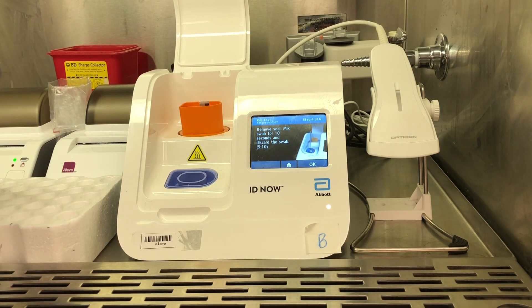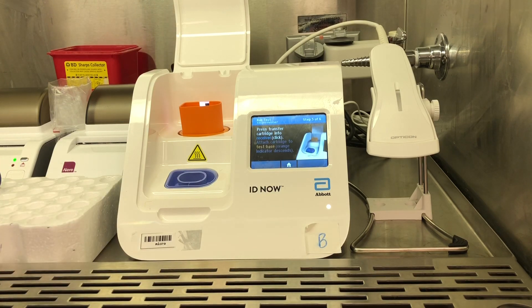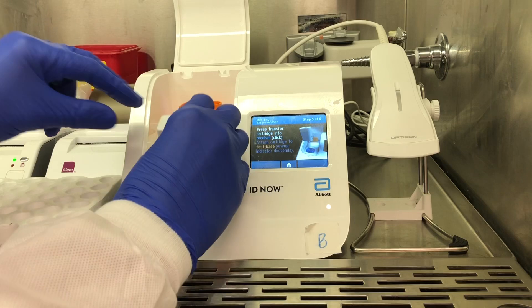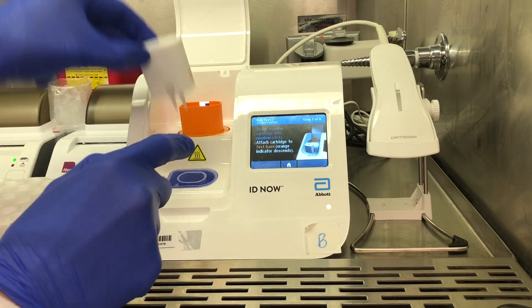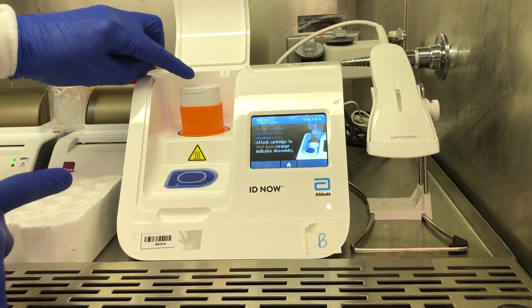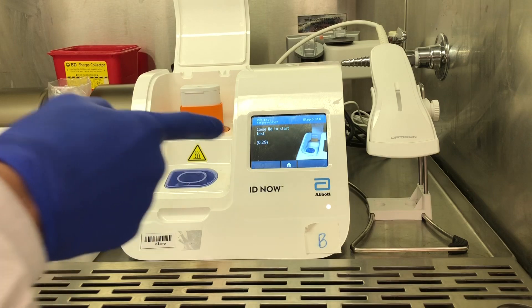After you're done mixing your swabs, you'll press OK, and then you'll take the transfer cartridge — also from package 2 — and press it into the sample holder. You want to make sure the orange dot on top comes up, which means it has aspirated some of the sample. Then when you press it into the test base, you want to make sure the orange dot goes down, meaning it has dispensed into the test base.